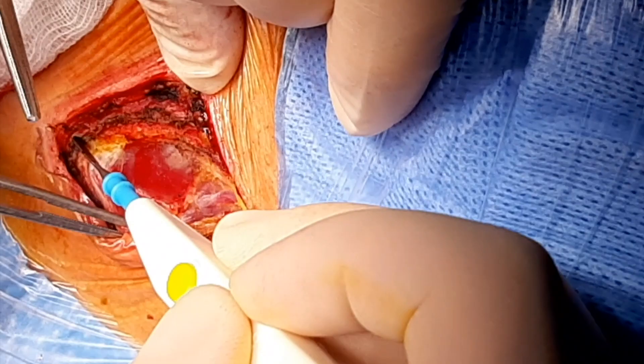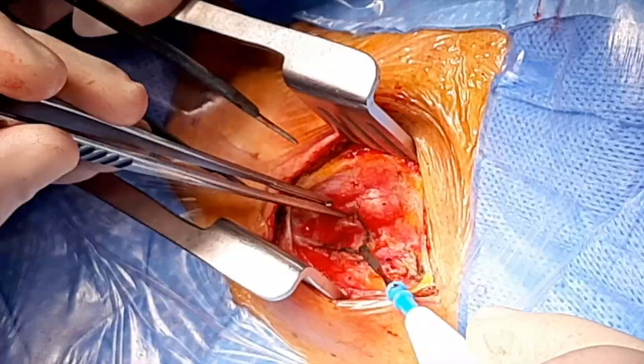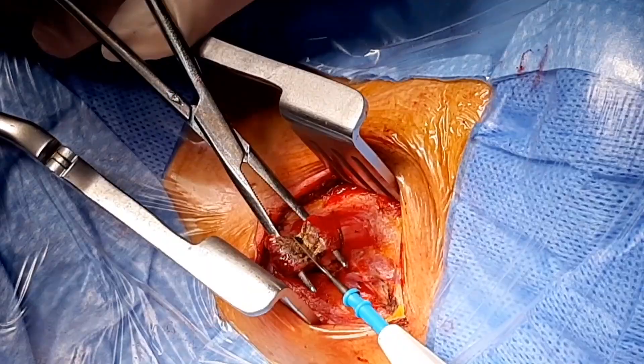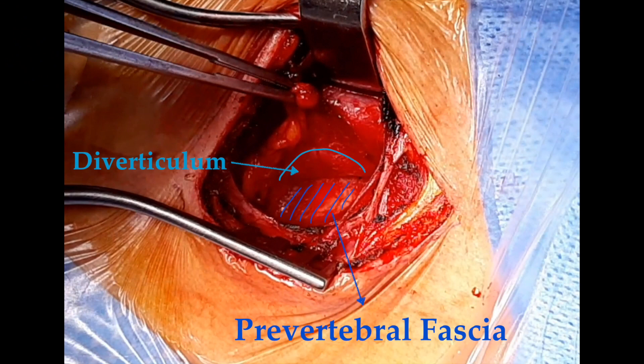The dissection continues over the platysma and deeper over the margin of the sternocleidomastoid muscle, which is retracted. We go deeper, isolating the omohyoid muscle, which needs to be divided in order to find the Zenker diverticulum. We are now almost over the prevertebral fascia, where the Zenker diverticulum is typically found lying at the back of the esophagus.